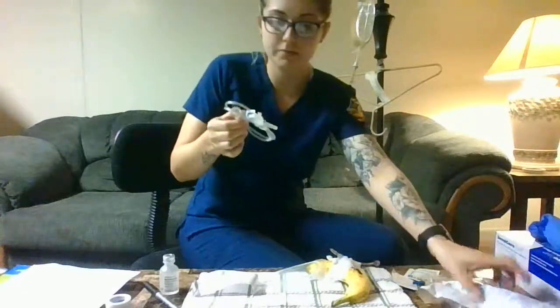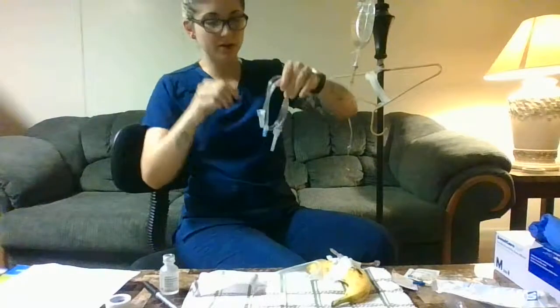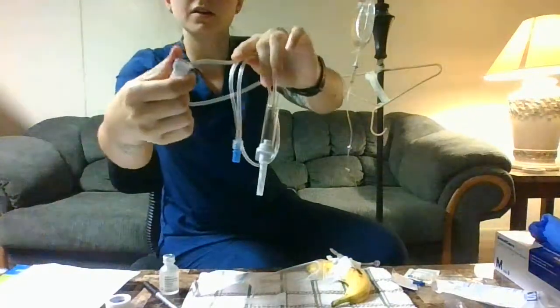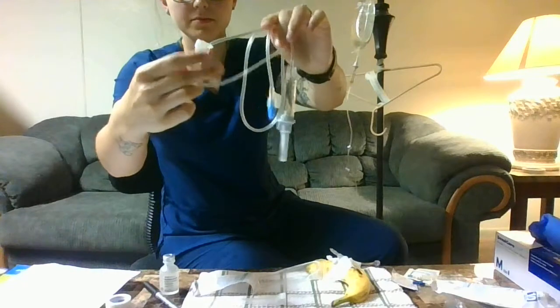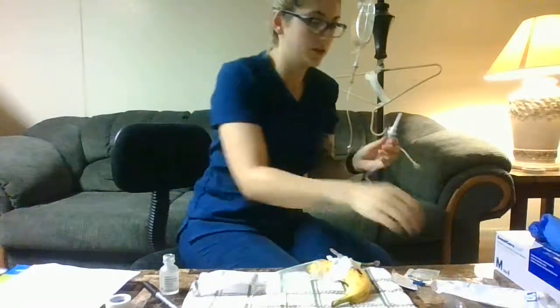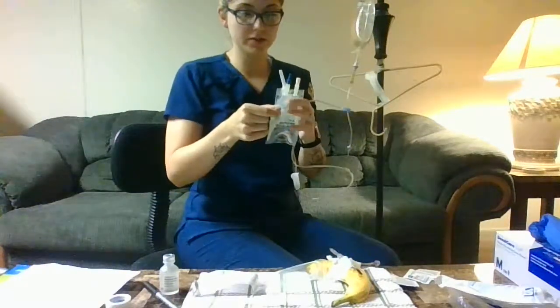Pull out our tubing. We're going to want to clamp it right away. So bring it all the way to the end. So you're going to close that secondary tubing. Then we're going to put it into our little bag of the 0.9 NS 50 milliliters.